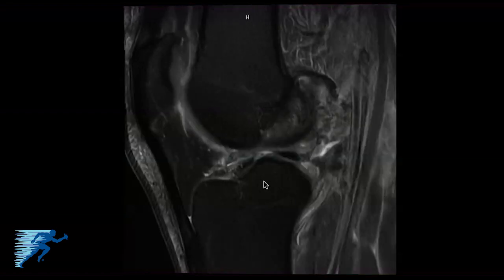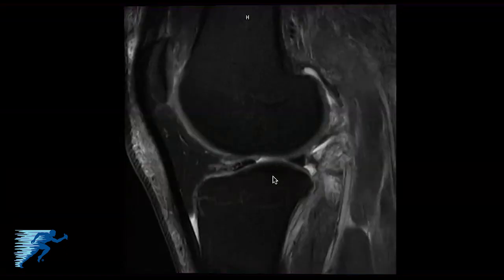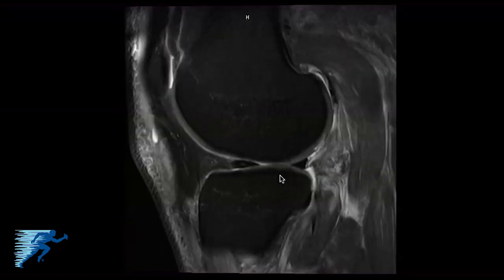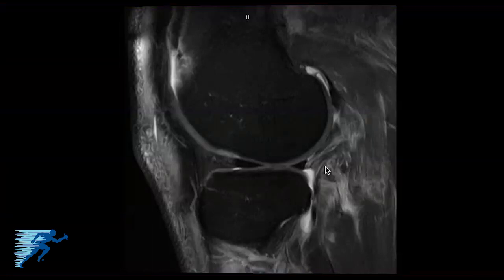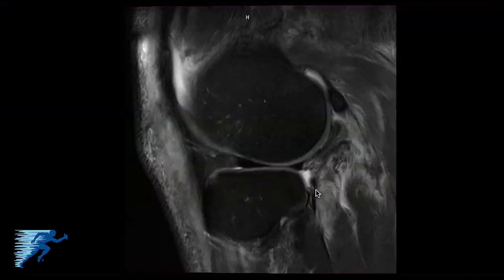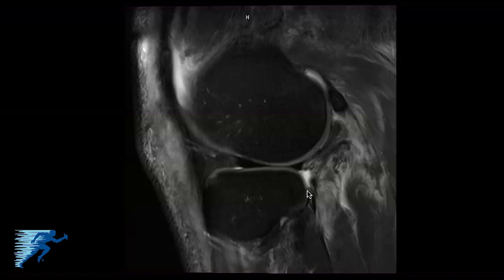As we course more laterally, we'll look at the lateral meniscus, and you can see some of the posterior capsule injured here. Another thing to recognize is the increased signal intensity that occurs in the popliteus muscle when there's an injury, as well as the anterior subluxation of the tibia compared to the femur. Here's the fibula, and the posterior capsule looks disrupted, with increased signal intensity indicating an injury to the popliteus muscle.